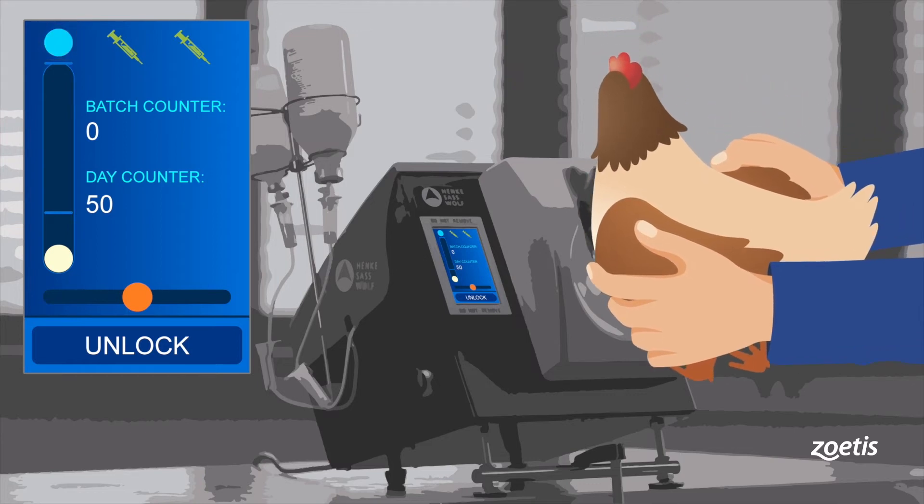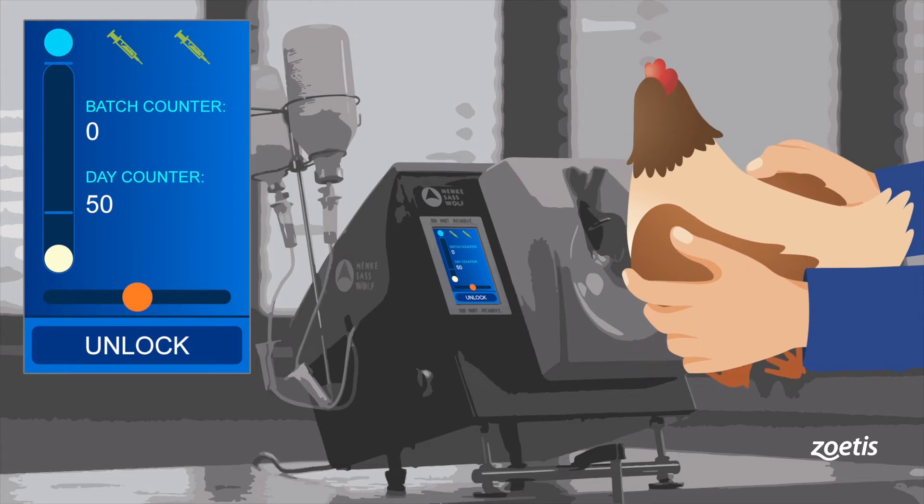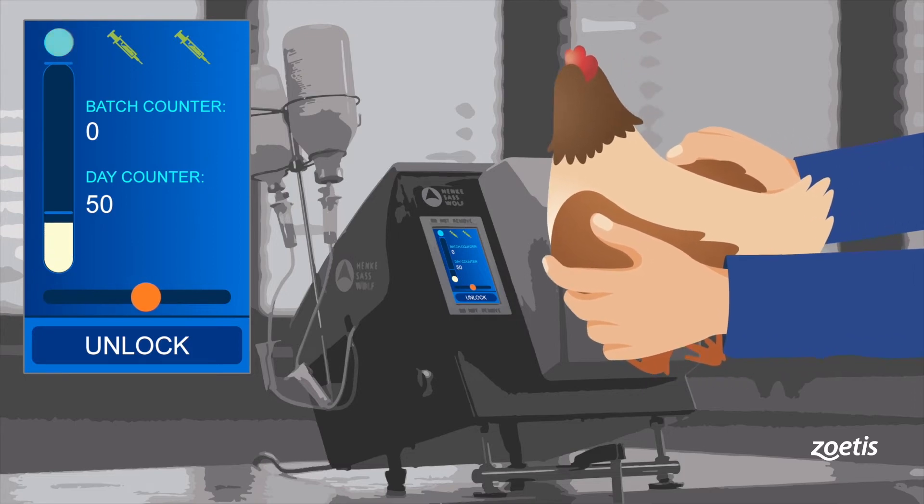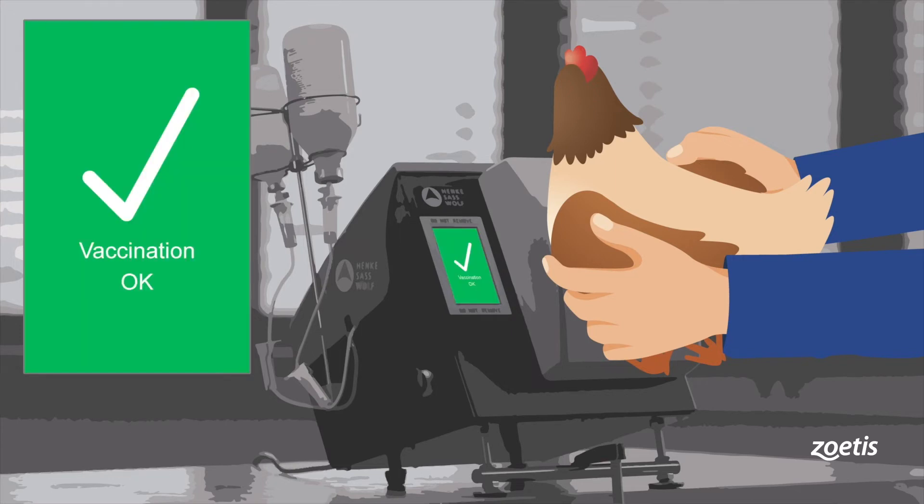The chicken is positioned correctly when all three sensors turn green. At the same time, an injection is released and its proper administration will be confirmed on the display.